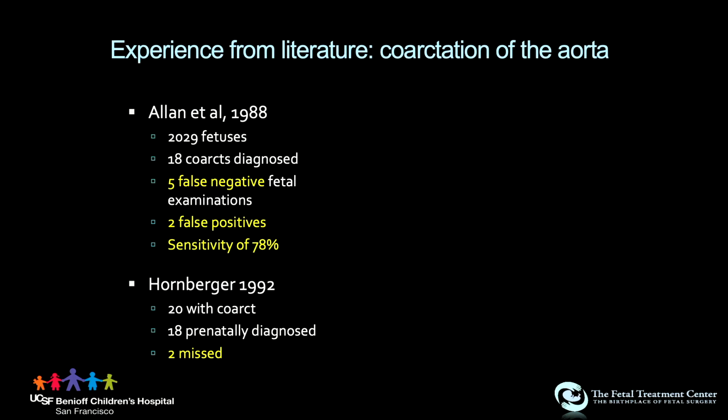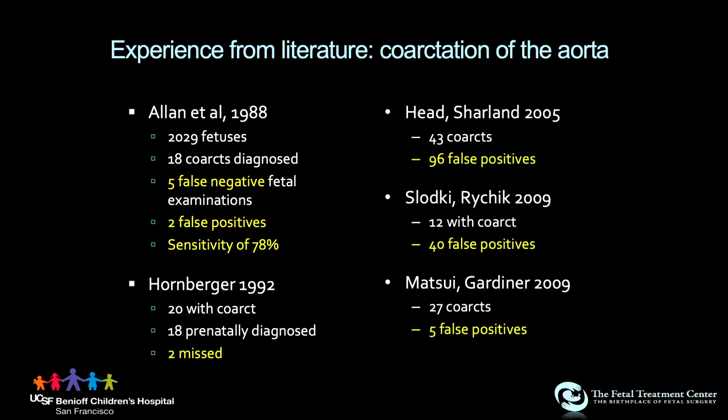So what has been our experience overall? Well, if you look at the literature, the earlier experience with fetal detection of coarctation was one of mostly false negatives, which we really don't want. This resulted in a lot of misdiagnoses, which can lead to devastating consequences if not identified early postnatally. But now in the current era, what we're dealing with is mostly a problem of false positives, which could be a good problem in one respect, where we have fewer false negatives, so fewer babies getting into trouble after birth.